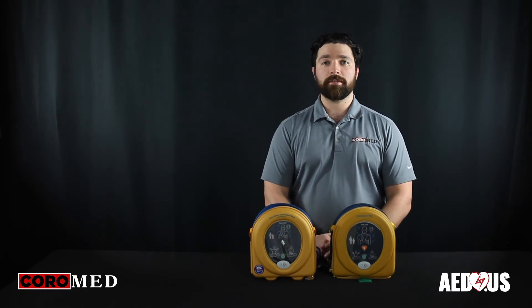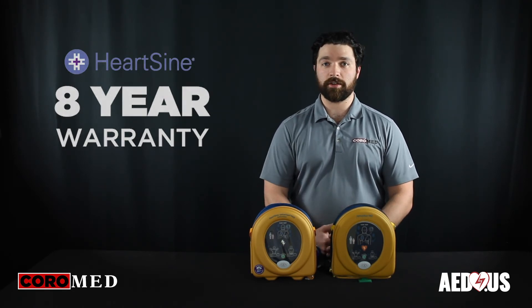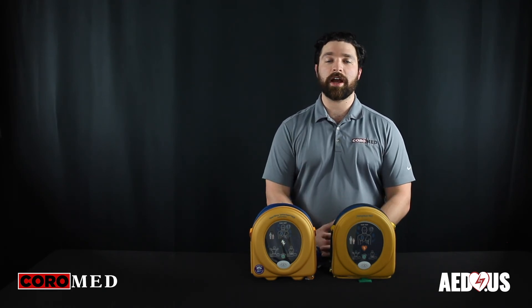New devices come with an eight-year manufacturer warranty, which is actually the longest in the industry. This means that at this point, nobody has an excuse not to be prepared for a sudden cardiac arrest event.